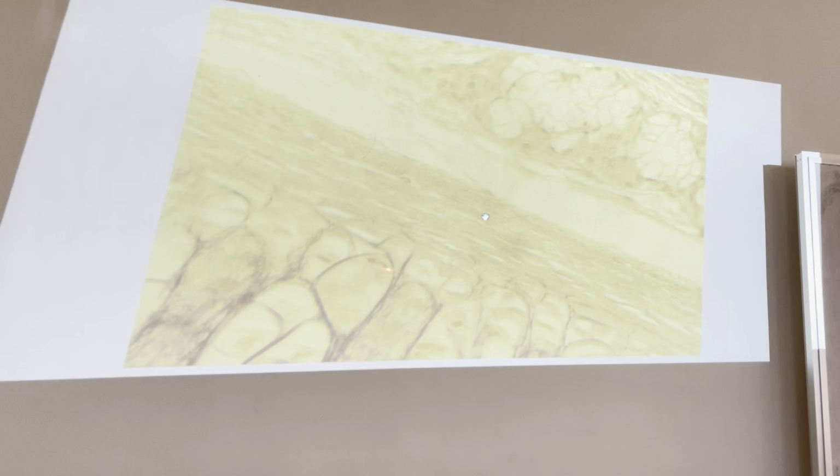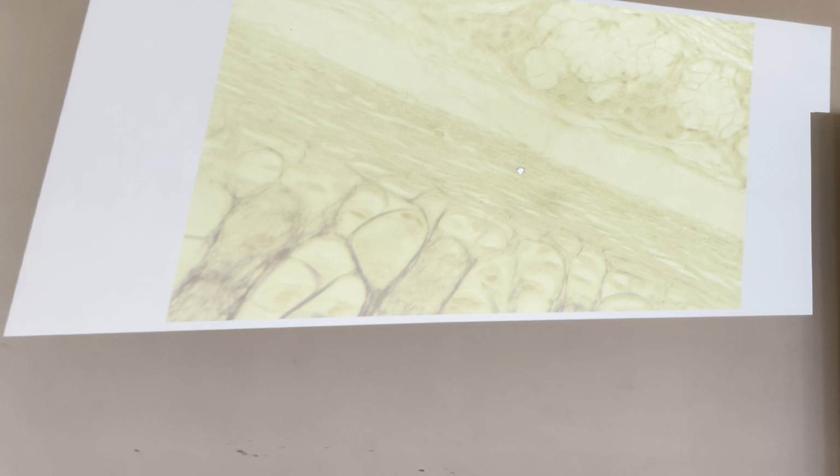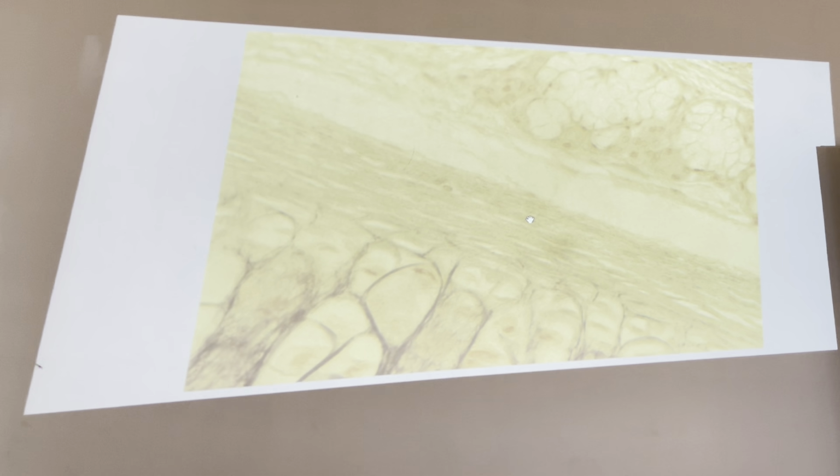This is the nucleus of a chondrocyte, which is located inside the lacuna.